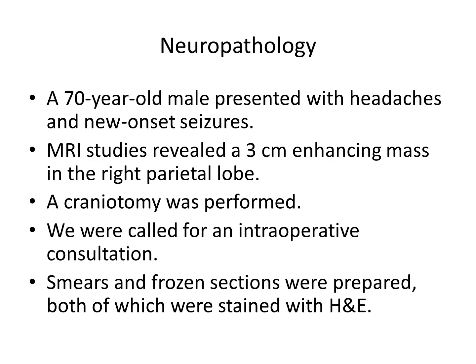A 70-year-old male presented with headaches and new-onset seizures. MRI studies revealed a 3-centimeter enhancing mass in the right parietal lobe. A craniotomy was performed. We were called for an intraoperative consultation. Smears and frozen sections were prepared, both of which were stained with H&E. We will begin with the smears.